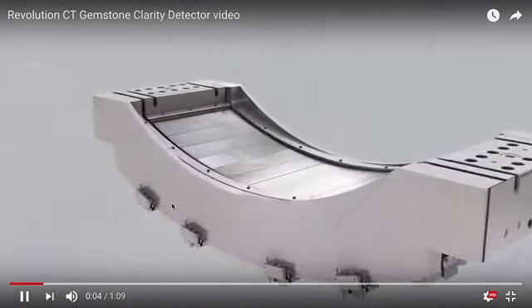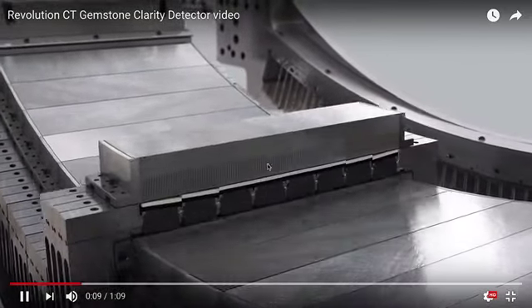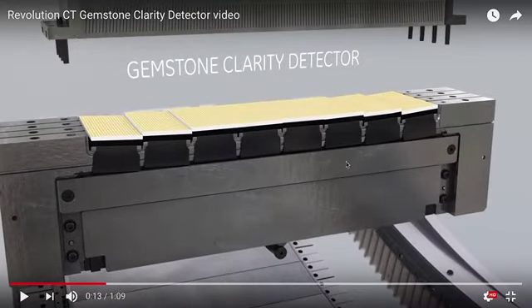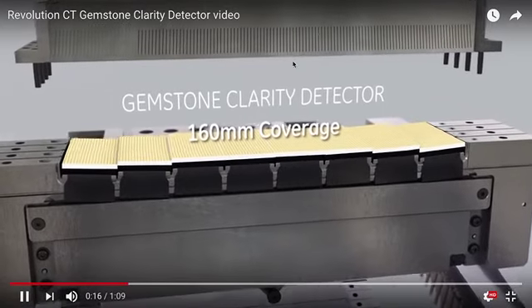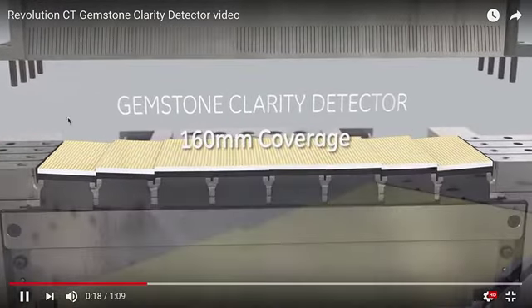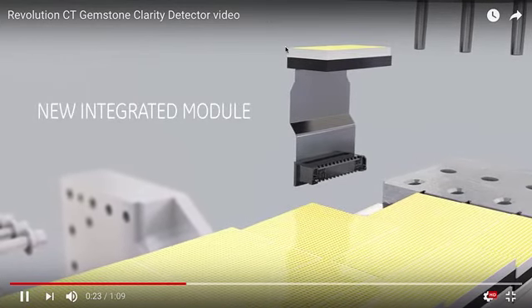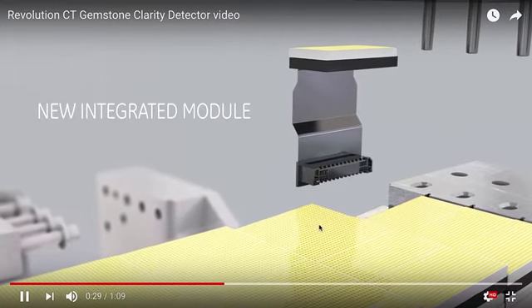So this blows up the detector. It's compartmentalized into these units. This is the Z direction, the slice direction. Multiple detectors like this are stacked parallel to go in the theta direction. Inside each one of these, we have this anti-scatter grid above. This gives us our 160 millimeter coverage in Z. And then these little chiclet guys have, I think, 16 by 32 detector elements on them.